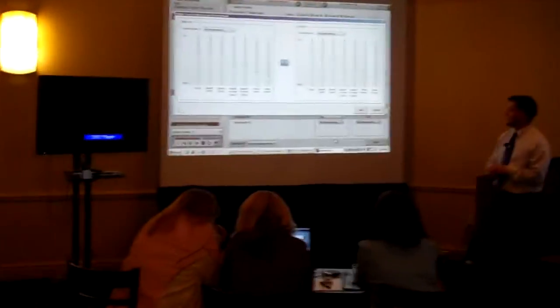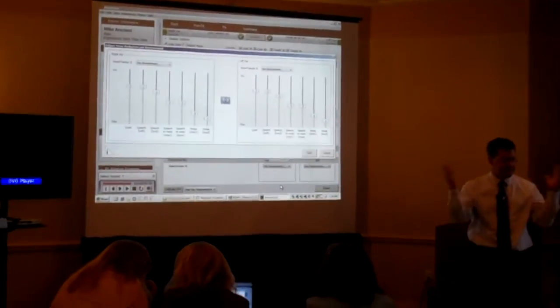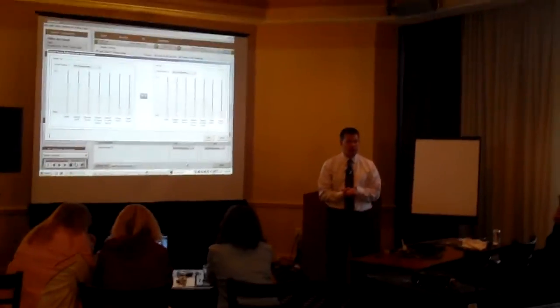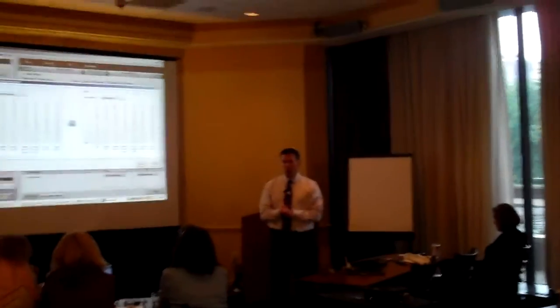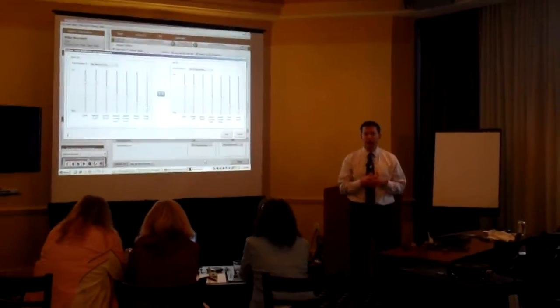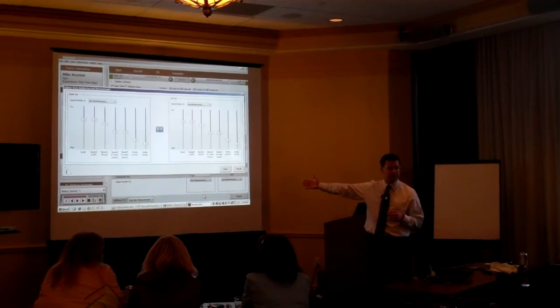Now, just looking at this screen, let's pretend we have a brand new patient — a 72-year-old woman who's never worn a hearing aid before. If you want to take an educated guess, what would be one thing you would probably do for a brand new fitting that you can do now with this noise reduction for environment?